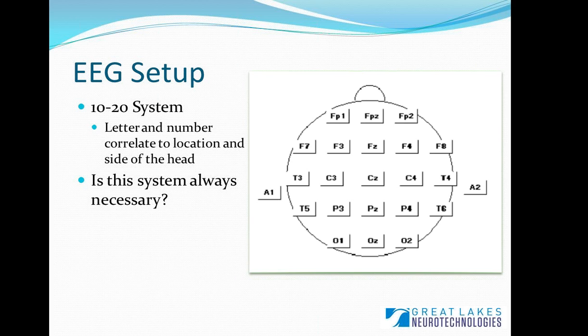6. So if you think about all of the information that's being extracted from the EEG signal during sleep, where sleep is being staged according to the different levels, 1 through 4, and then also REM sleep, even things like seizure activity can be detected as somebody is falling asleep. All of that information can be extracted from just 6 electrodes placed on the head.